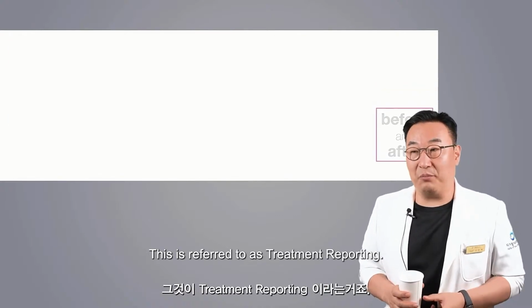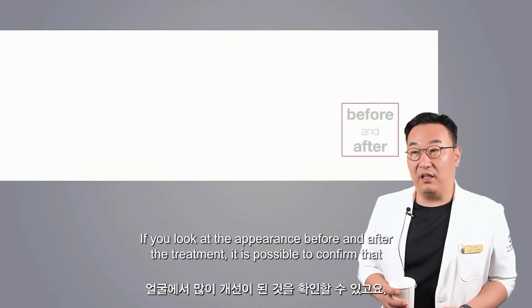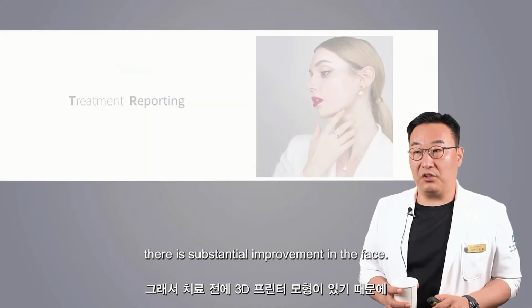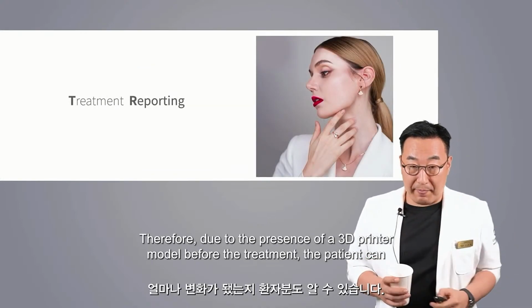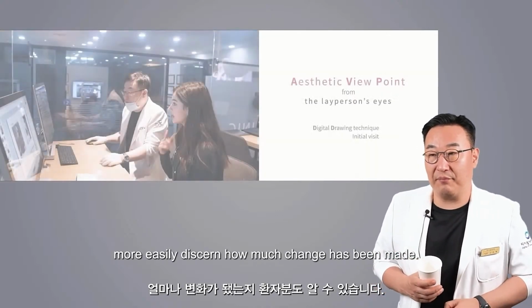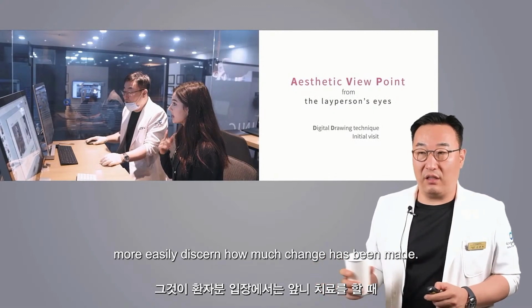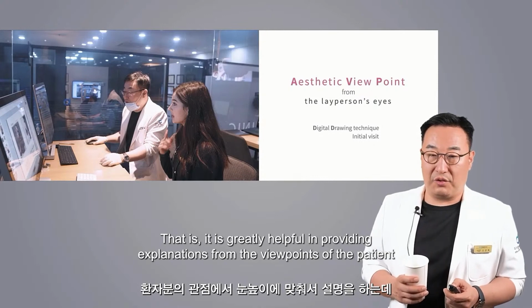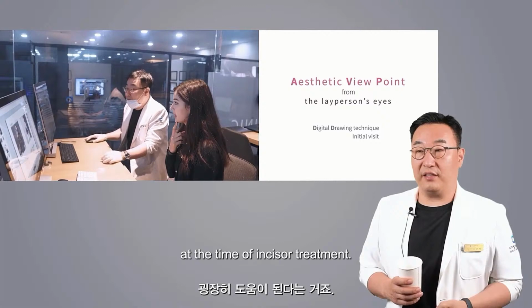This is referred to as treatment reporting. If you look at the appearance before and after the treatment, it is possible to confirm that there is substantial improvement in the face. Therefore, due to the presence of a 3D printer model before the treatment, the patient can more easily discern how much change has been made. That is, it is greatly helpful in providing explanations from the viewpoint of the patient at the time of incisor treatment.